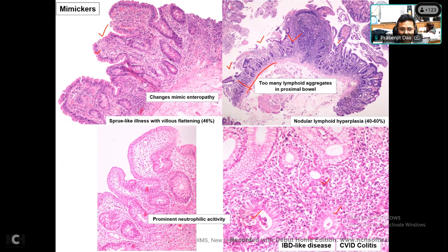You have to see if the consecutive crypts are perpendicularly oriented on the muscularis mucosa or not. If you see 3 to 4 crypts in a region perpendicular to the muscularis mucosa, you can think that this part of the mucosa is oriented. So here also we can take it as oriented because of the same rule.